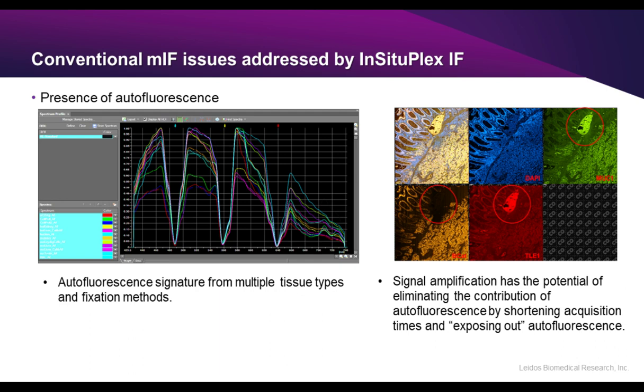How many slides can I stain and image in a workday? So I'll comment for what we can do internally, through our services lab and what they've typically done with our 4-plex assay. They can easily get up to 60 slides done in a day. Depending on what your shifts look like, you could even push that number upwards to close to 90. For the higher plex workflow, you can definitely get 30 slides completed in a day as well. But Scott, feel free to comment on what your experience has been in your specific laboratory.